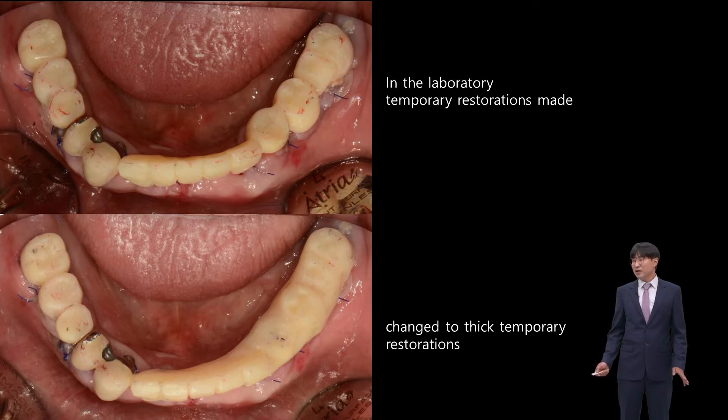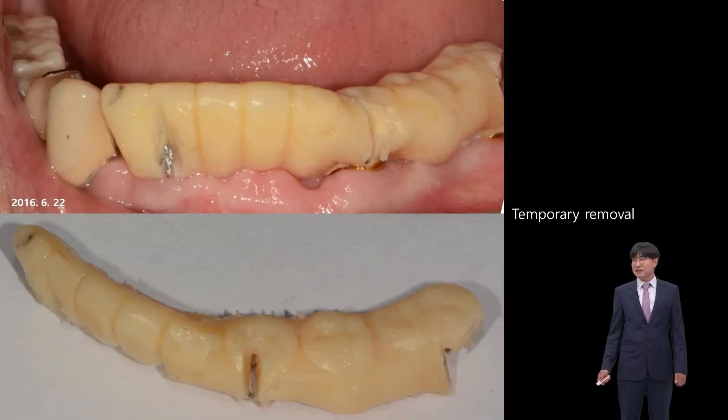Even the thick restoration should have sufficient interdental spaces so that the patient can do maintenance. In this case, the temporary restoration is not removed with an ejector or caliper, but is being cut with a burr. Let me explain why.